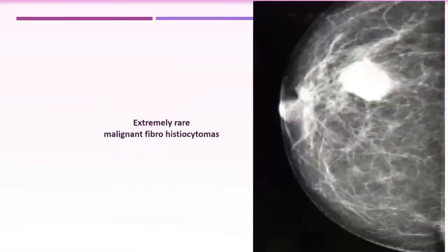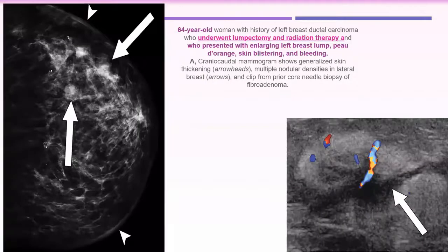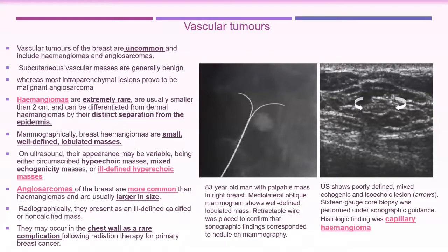Okay. Yeah. This is an extremely rare malignant fibrous histiocytoma. Okay? Also, it is a mimicker for breast cancer. We talked about the fibrous lesions in the stromal component, and he said non-specific stromal lesions or stromal tissue in the breast, including fibrous, vascular, lymphatics, skin, fat, and so on.